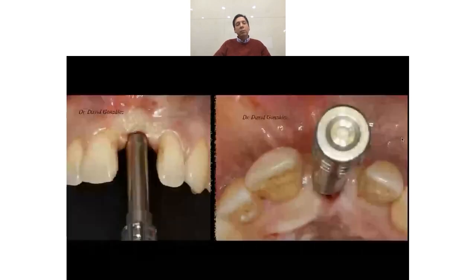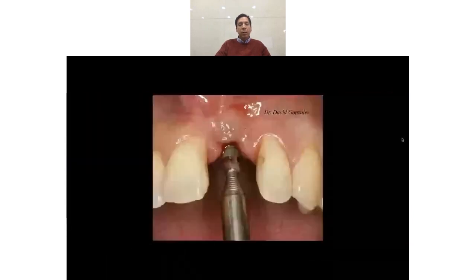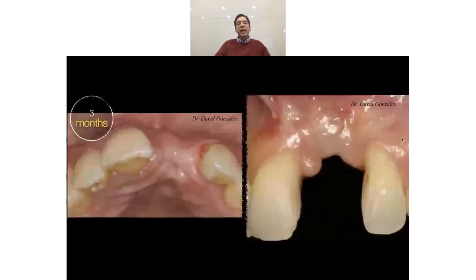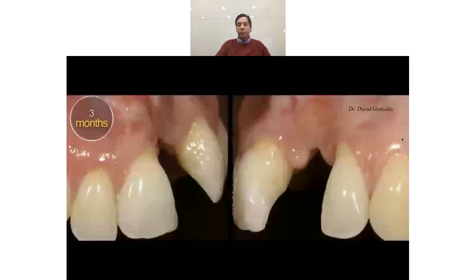But we managed to introduce the implant retriever without raising a flap, and we managed to remove the implant in an automatic way. And this is the aspect 3 months after implant removal. We can see the healing of the soft tissues. And now we're going for the surgery.